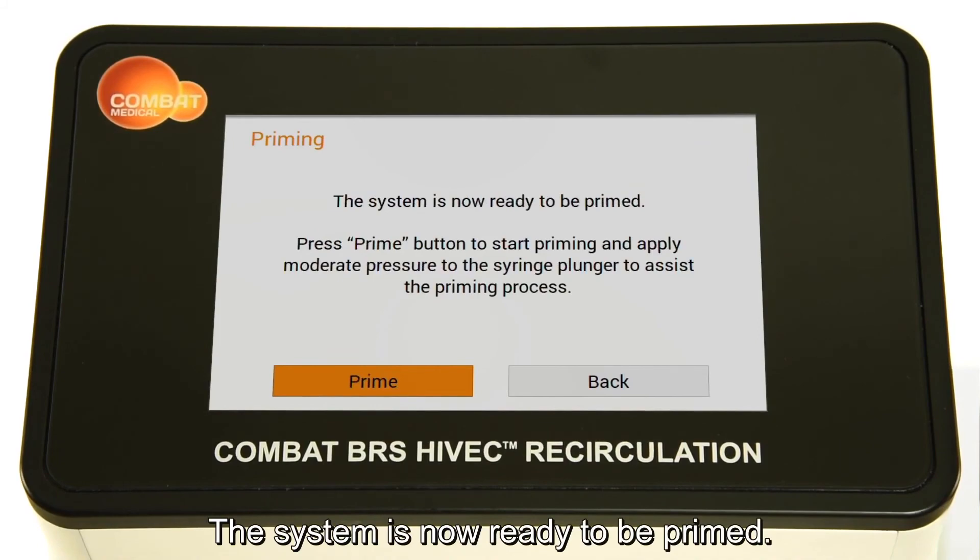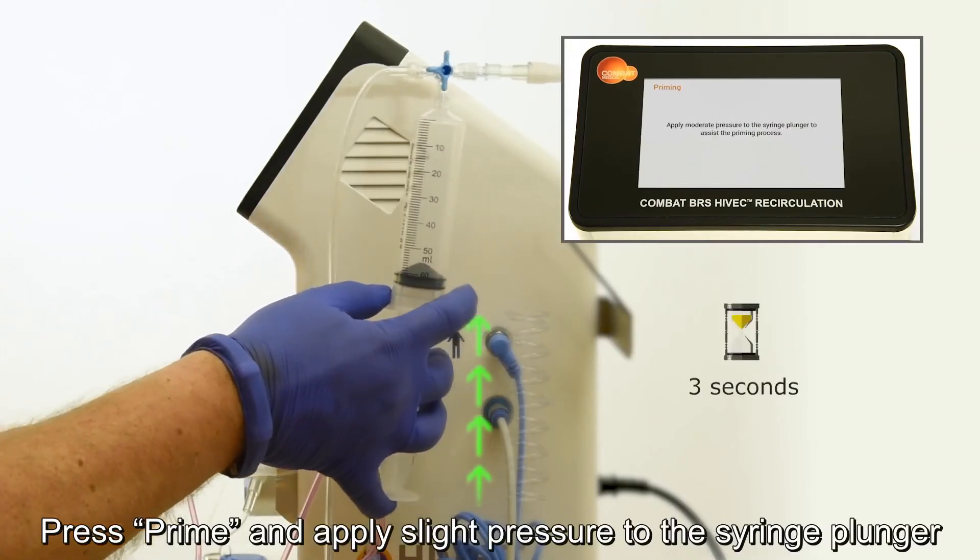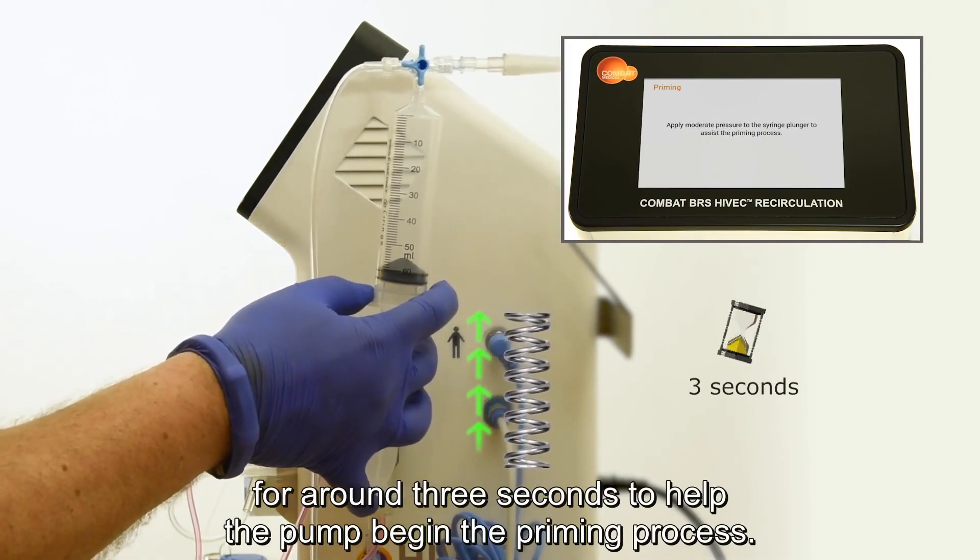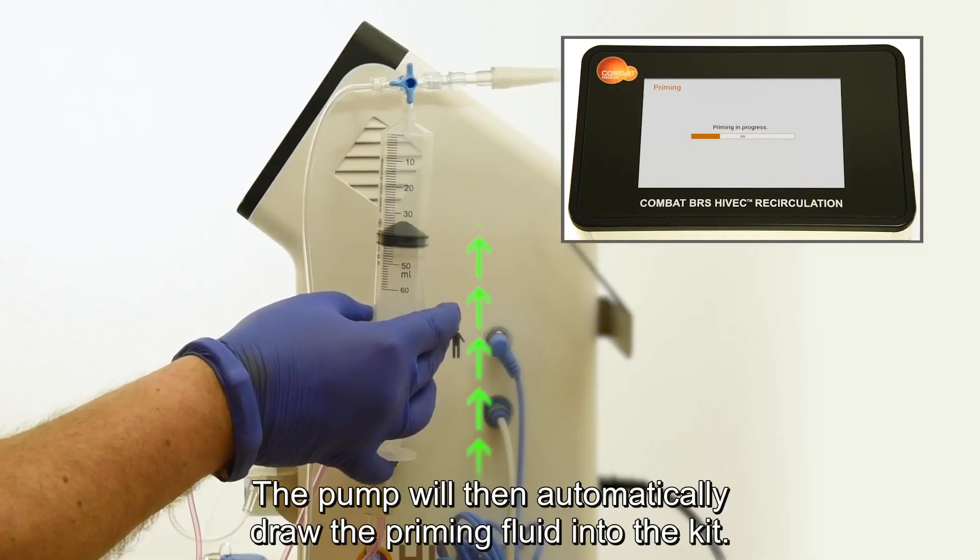The system is now ready to be primed. Press prime and apply slight pressure to the syringe plunger for around three seconds to help the pump begin the priming process. The pump will then automatically draw the priming fluid into the kit.